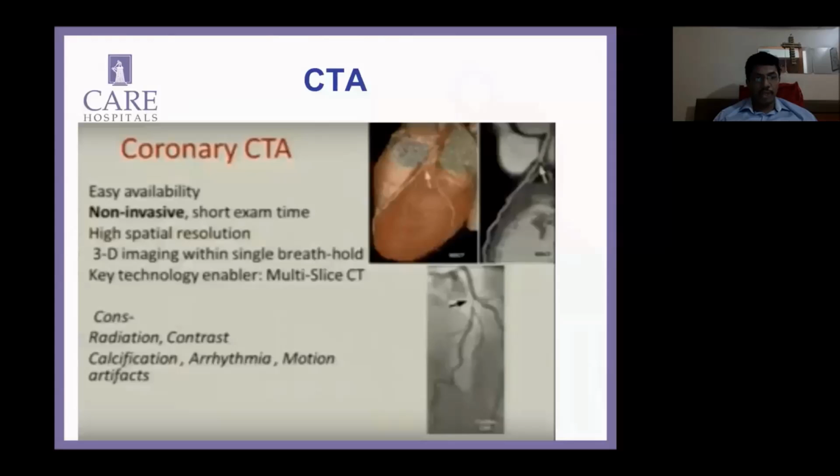We are doing coronary CT for all of our patients who are undergoing AF ablation. So we do what is called an LA map or a pulmonary venous map. And we do that with fairly variable heart rates. We get some very good pictures, and this is superimposed into the Carto lab, and it becomes very easy for the operator. The time taken to ablate just comes down, and the completeness of the ablation again becomes really, really good with this.